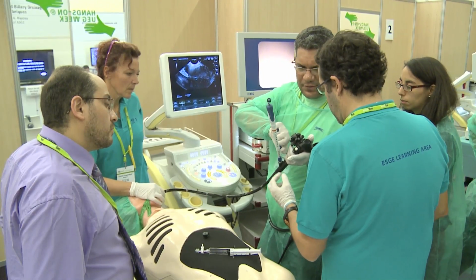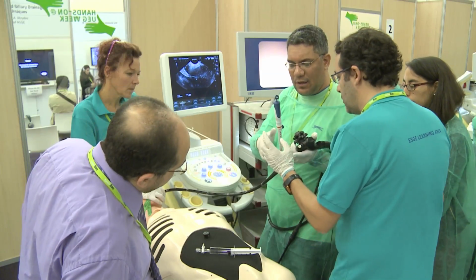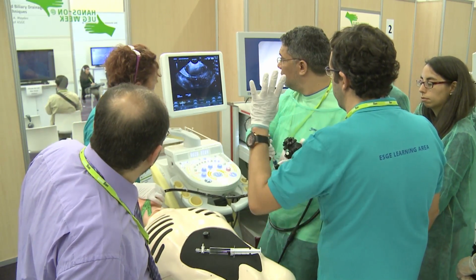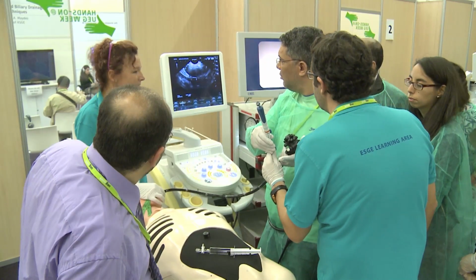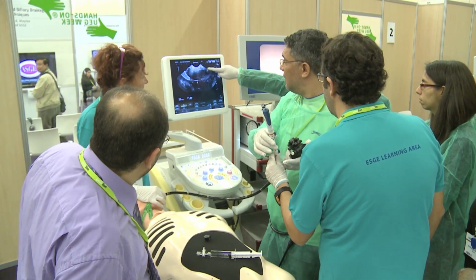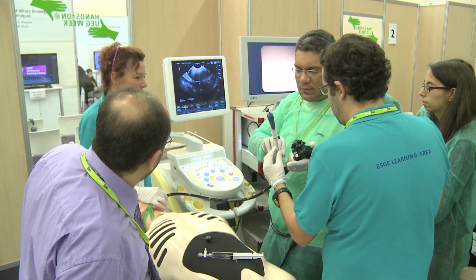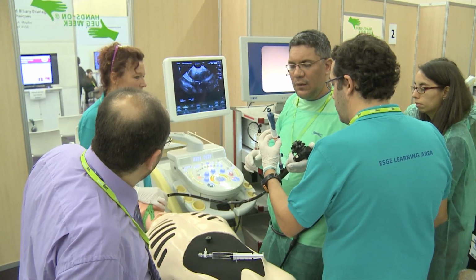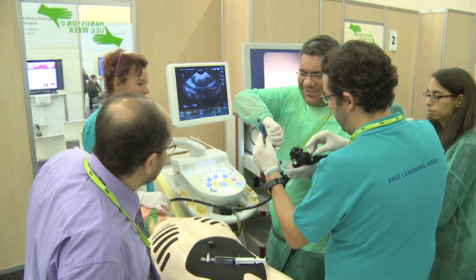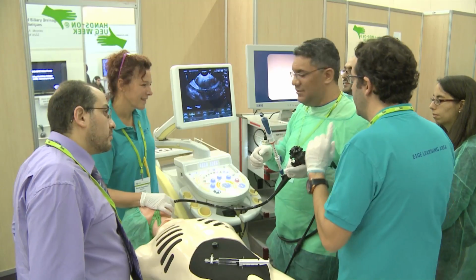Left side or the other side? Left side? No, this is the other side. Okay, now try to bring it down until you see it coming out. Perfect. One finger, remember, the row, one finger. And when you have one finger, you stop and lock it. And then you release this part. No, this is very good. Okay. And now is the time for the elevator.